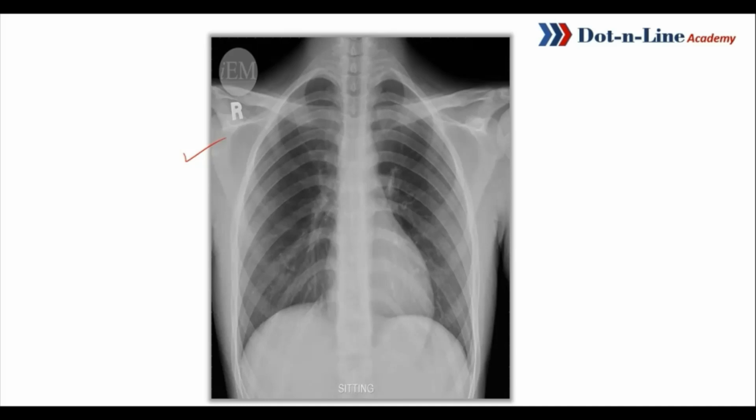Like here in this X-ray, generally we see ribs. Okay, these are ribs. This is the clavicle. This is the vertebra. A general person with knowledge of general anatomy can detect these things. But can you see this heart here? The spinous processes of the vertebrae. The bronchial division.